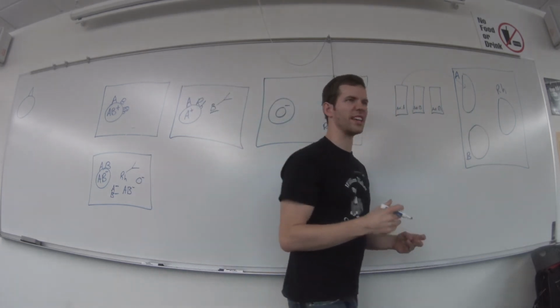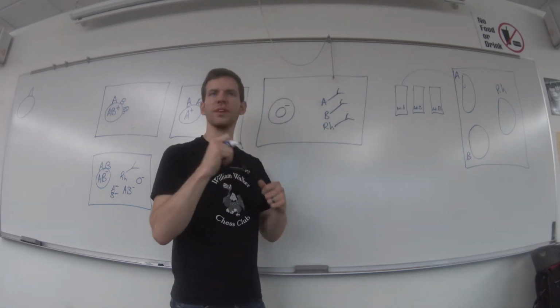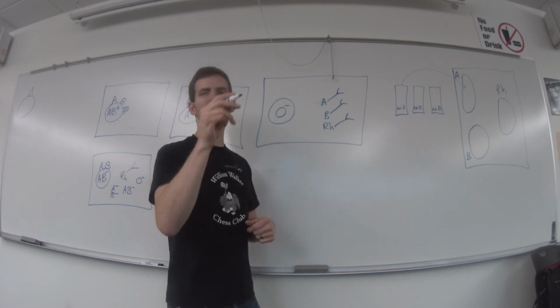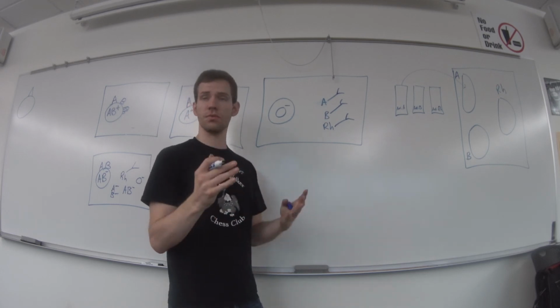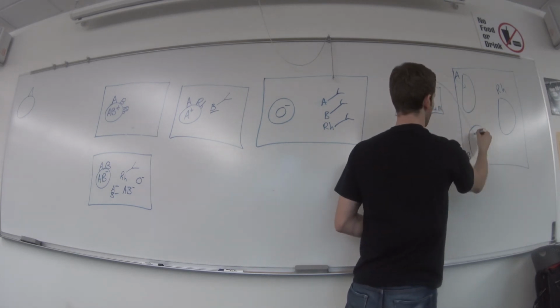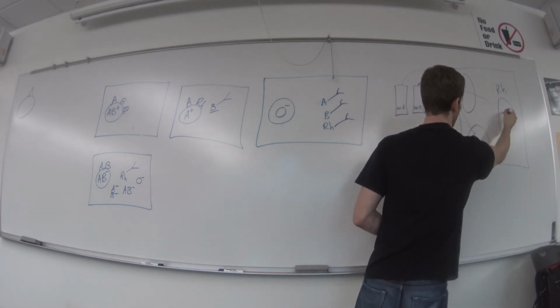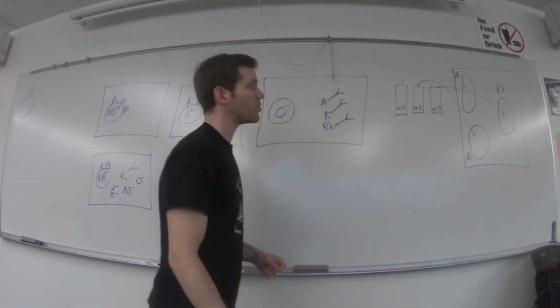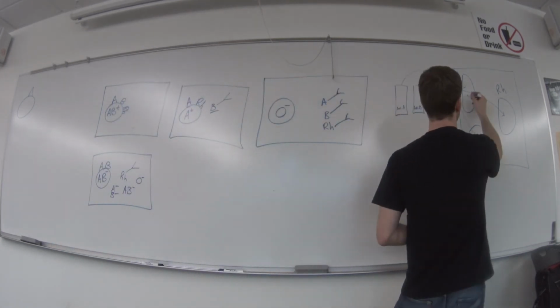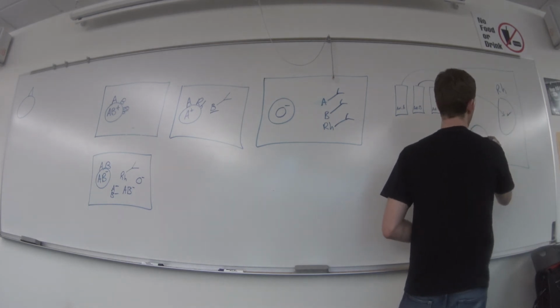And what that looks like is your blood clumps together in little clumps, and you can't mix it back together, so you have little toothpicks to try and mix it. If it doesn't mix back together, then you've seen agglutination. And then you're going to do the same thing with B, putting it in here, and the same thing with RH, putting a drop in there. And so, for me, because I'm AB positive, I would expect to see agglutination in all 3 of these wells.